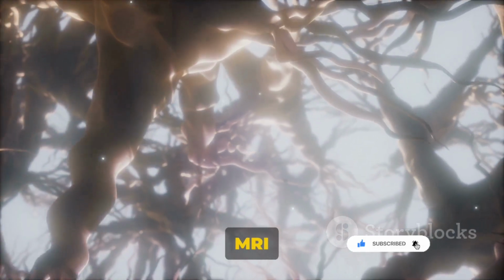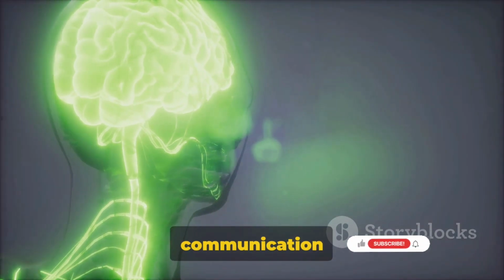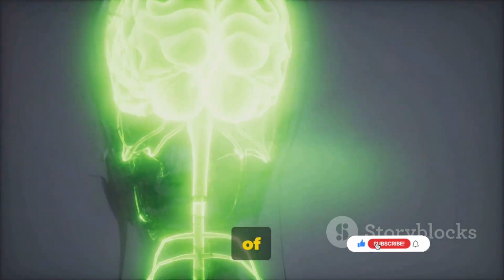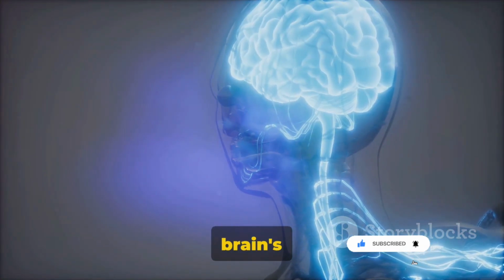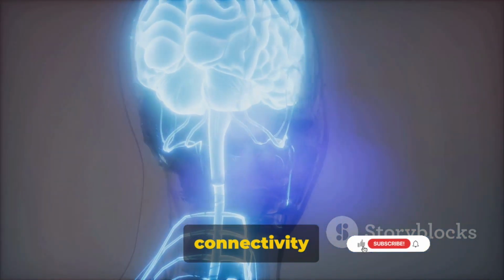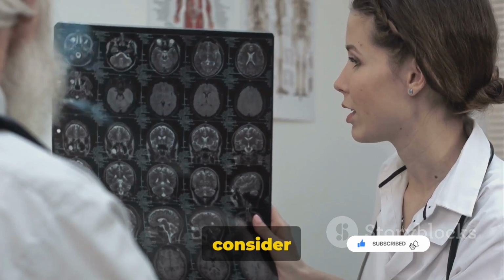DTI is a type of MRI that delves into the brain's white matter tracts, the brain's internal wiring that facilitates communication between different regions. By tracking the diffusion of water molecules, DTI can map out these tracts, giving us a detailed view of the brain's structural connectivity. This is particularly useful in understanding conditions where this connectivity may be impaired, such as in traumatic brain injuries or neurodegenerative diseases. Let's consider a case study.